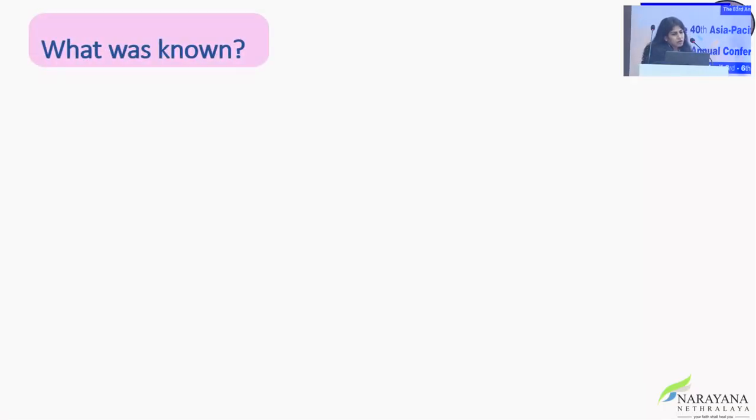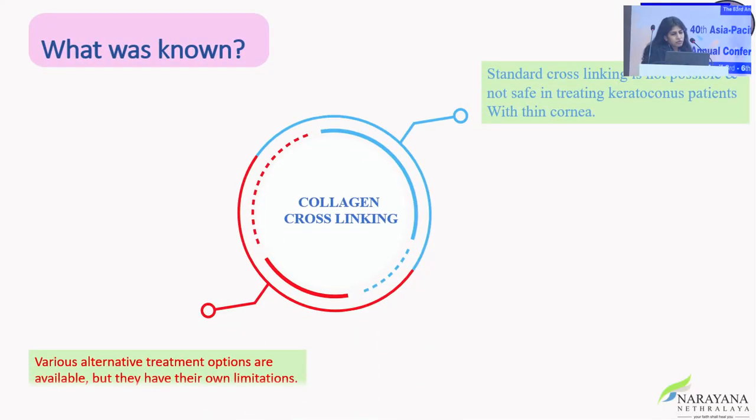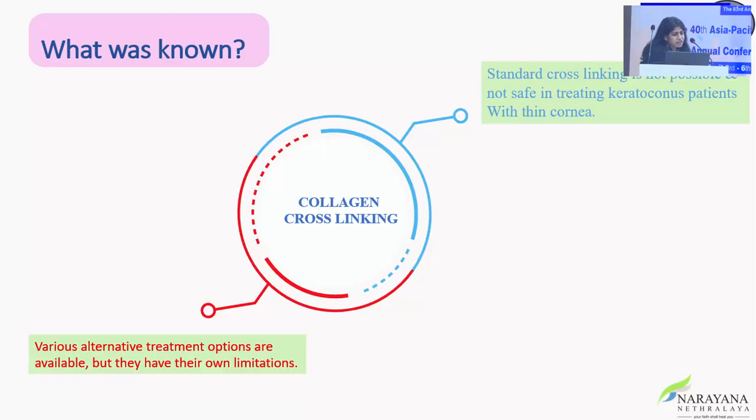A decrease in duration of corneal exposure to UV radiation can lead to increased patient comfort, relieve the potential exposure to corneal side effects, and delay the need for corneal transplantation.